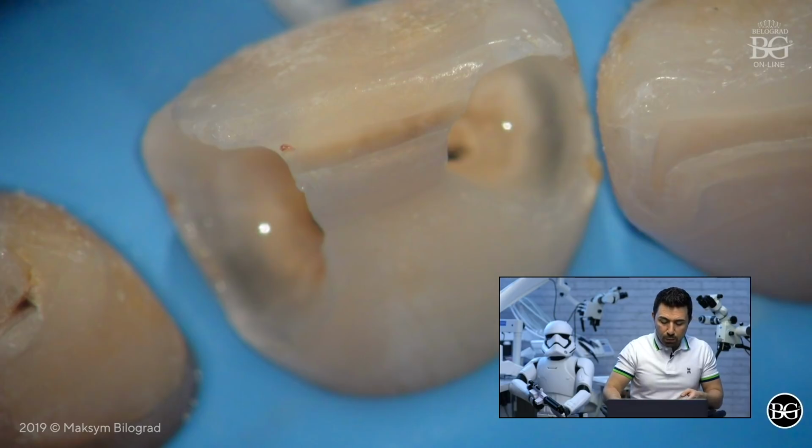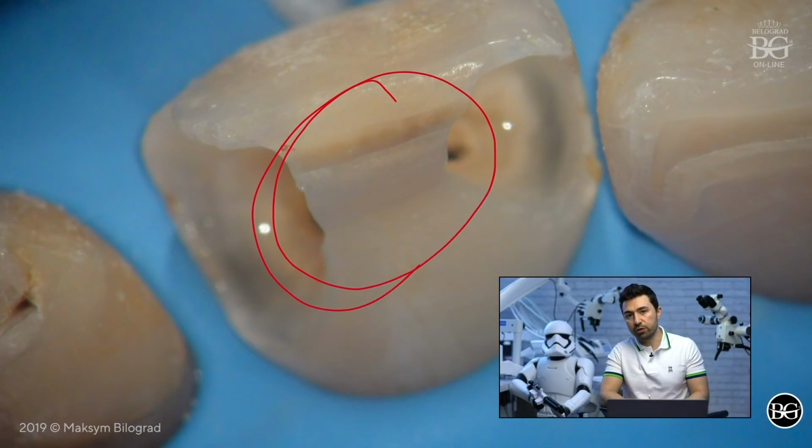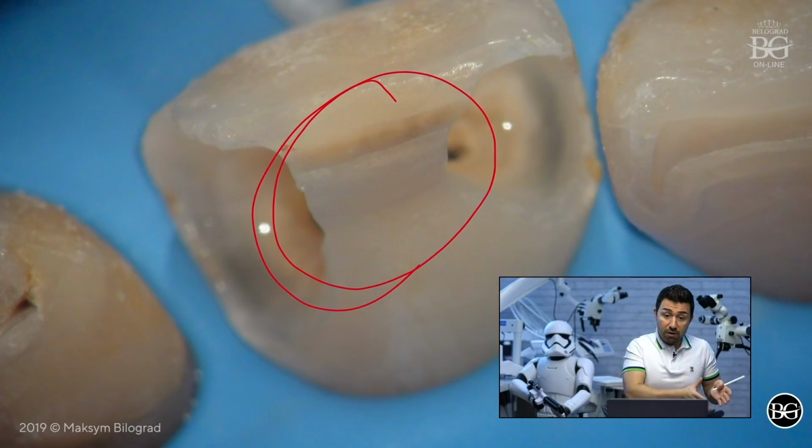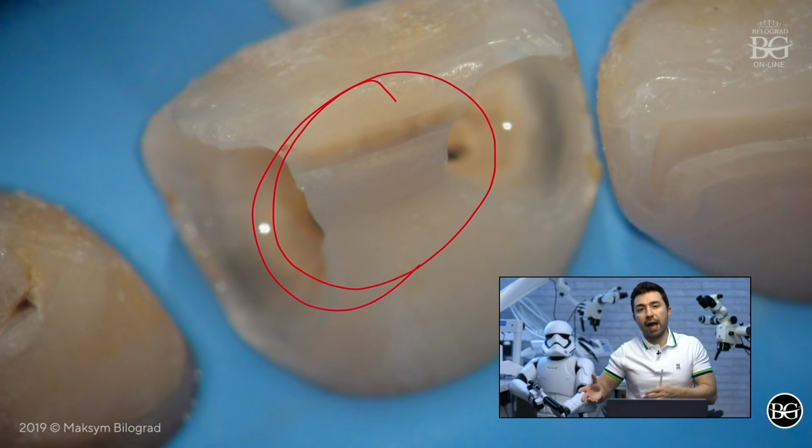Just imagine if we had to do a straight line access, okay? We would have to remove that amount of tooth structure to get this straight line. And at the end of the day, there would be no tooth, or let's say it would be a pretty big destructive case caused by caries defects and also caused by access formation.